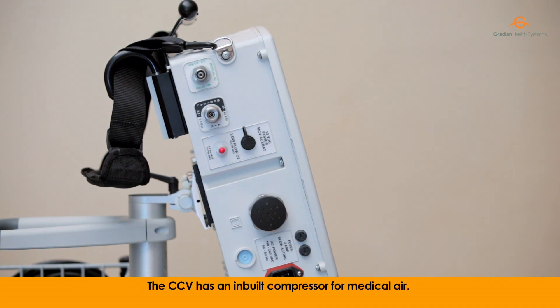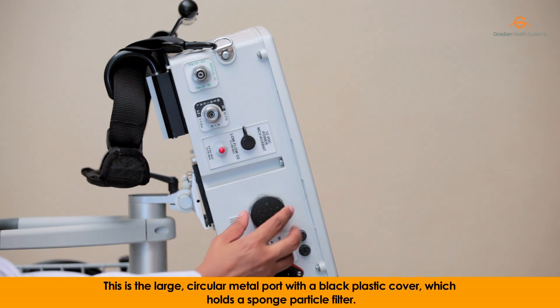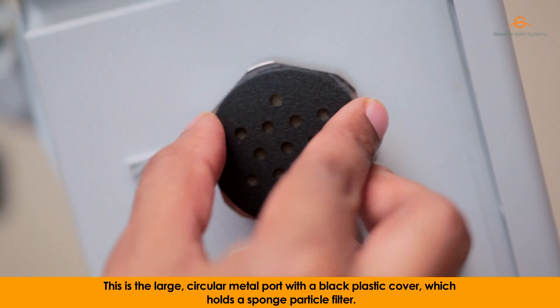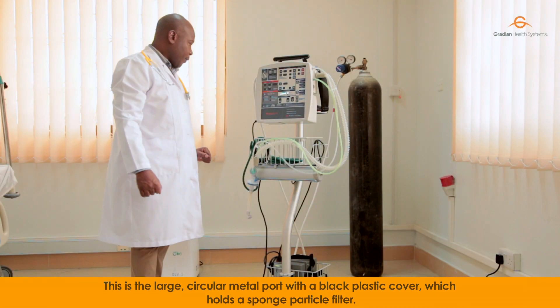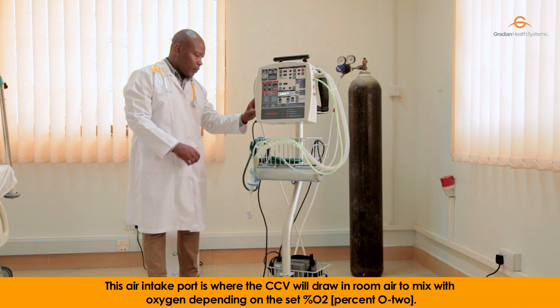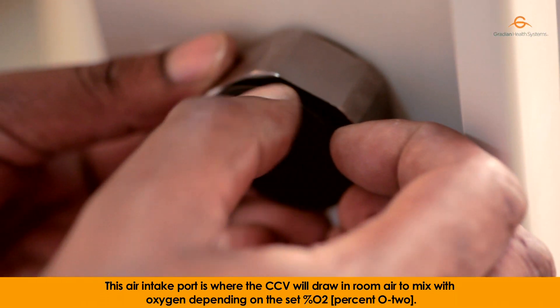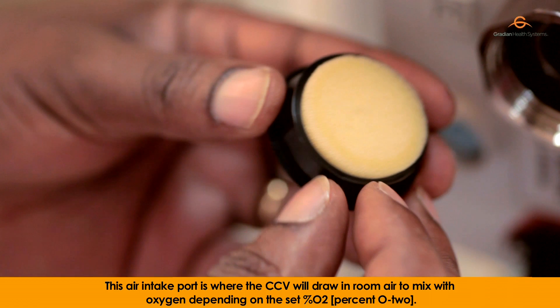The CCV has an inbuilt compressor for medical air. This is the large circular metal port with a black plastic cover which holds a sponge particle filter. This air intake port is where the CCV will draw in room air to mix with oxygen, depending on the set percent O2.